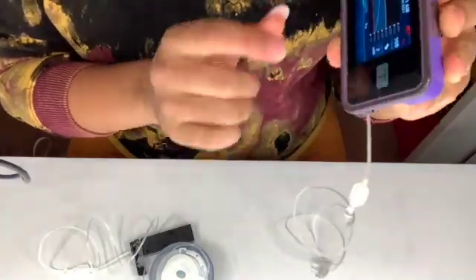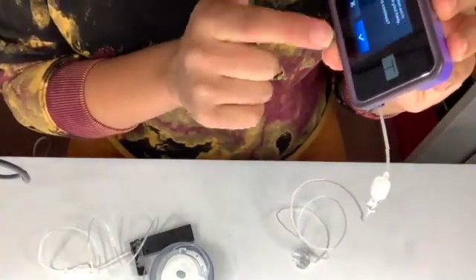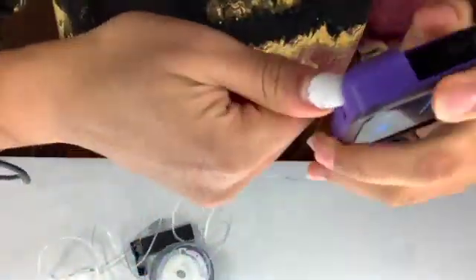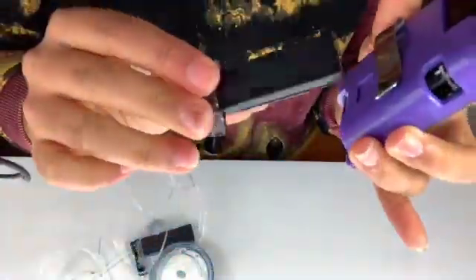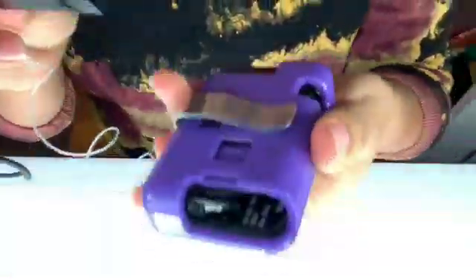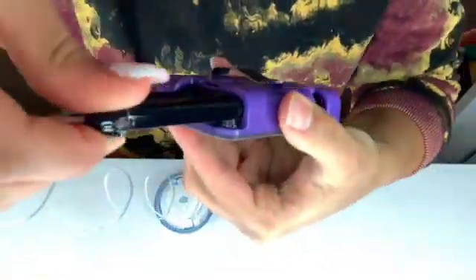So now we have to get the old cartridge out. So let's unlock our pump again. And then it's going to say, click this when it's ready. And basically you can use a keychain that the thing came with, or like a coin to pop out that last cartridge. And I use my fingernail because that's what acrylics are for, right?